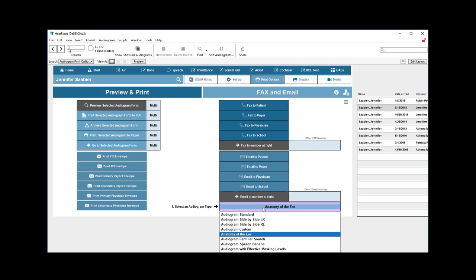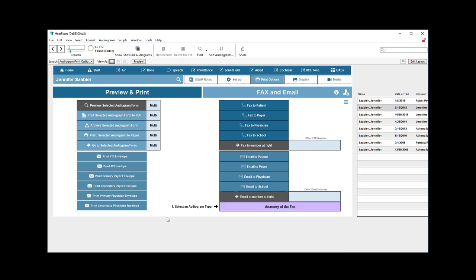So, again, you can decide. The familiar sounds, the speech banana, they're not really very impressive, but they're there if you need them. And, again, take a look at some of those different options that you have. The standard one might be appropriate for your needs.